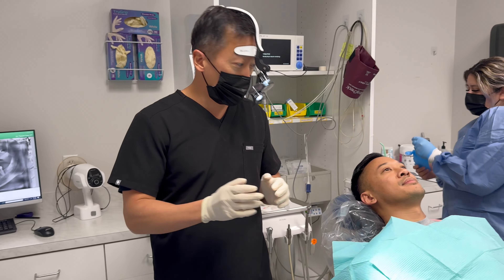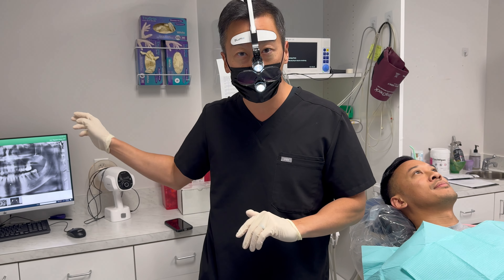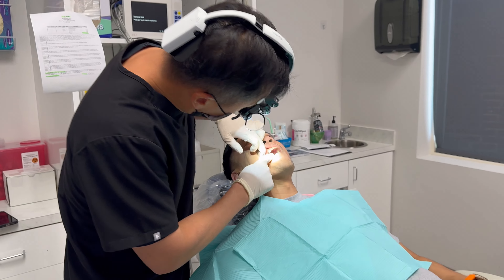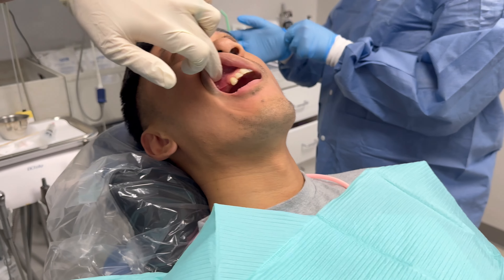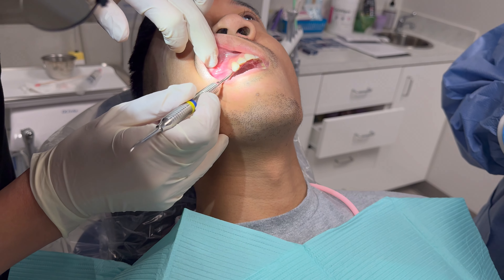I want to show you a case of dental implants. I didn't place these implants, but today I want to do an uncovering for this patient. He's actually a hygienist at our Grapevine office. You can see here on the upper right that we placed two implants that are buried in the gums so you can't see them.